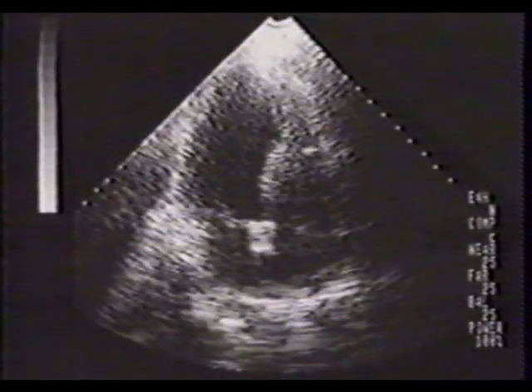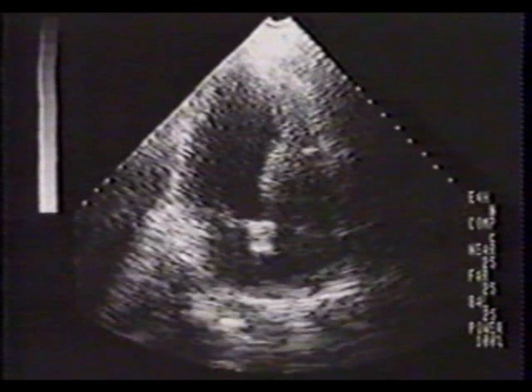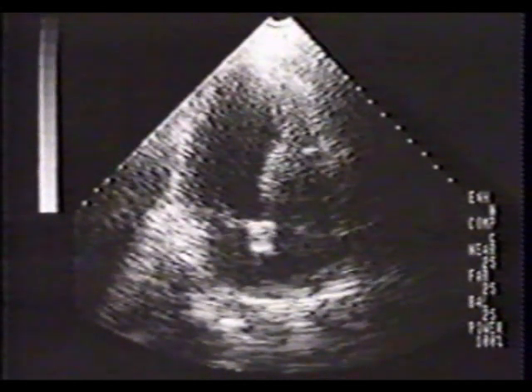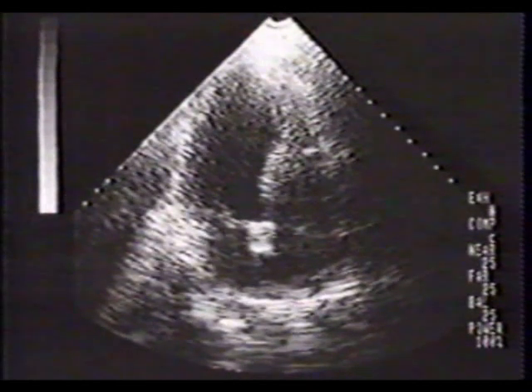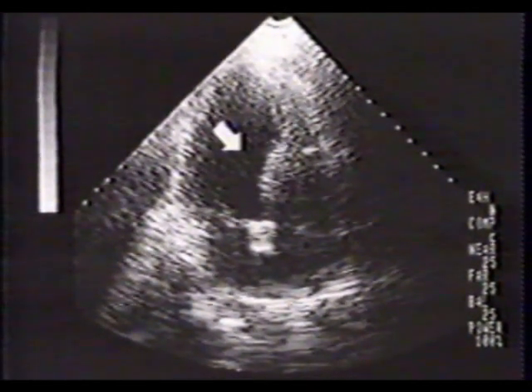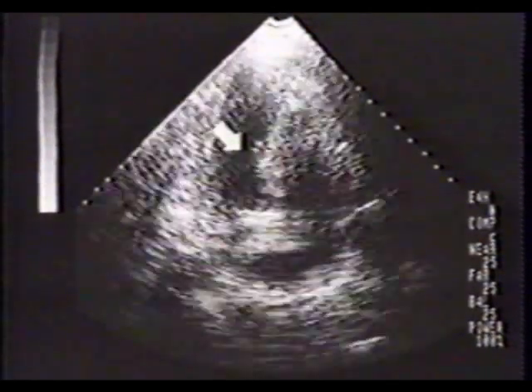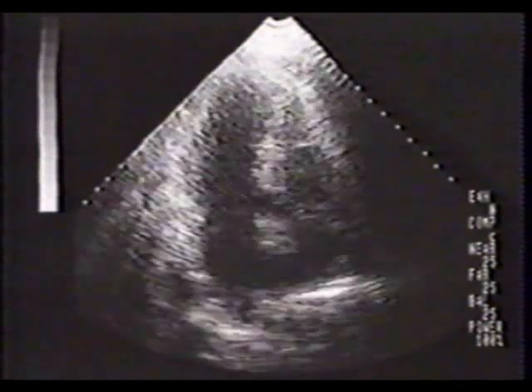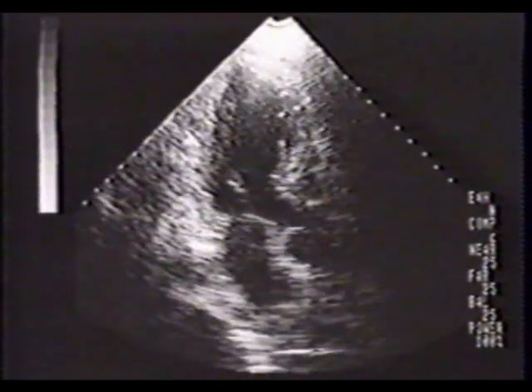This patient had an acute inferior infarction. He was initially stable, but became suddenly hypotensive with florid pulmonary edema. A new holosystolic murmur was noted. In this apical four-chamber view, you will notice that the global LV function is hyperdynamic. Perhaps you noticed the head of the ruptured posteromedial papillary muscle.